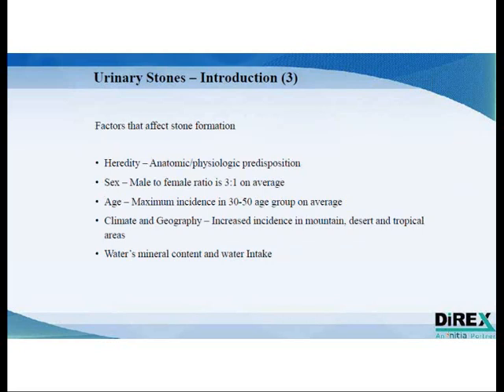Stone sizes vary. You can find stones anywhere from a few millimeters up to a few centimeters. Most stone sizes range up to 2 centimeters. Lithotripters are meant to deal with stones up to 2 centimeters in diameter. Any stone bigger than that may require some additional options, such as a laser.